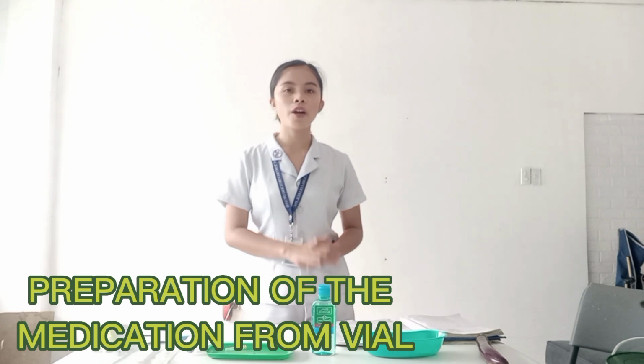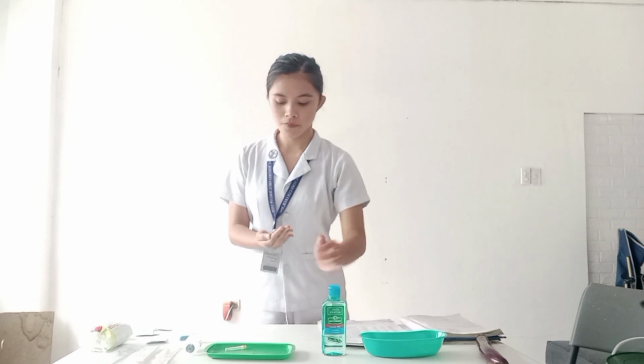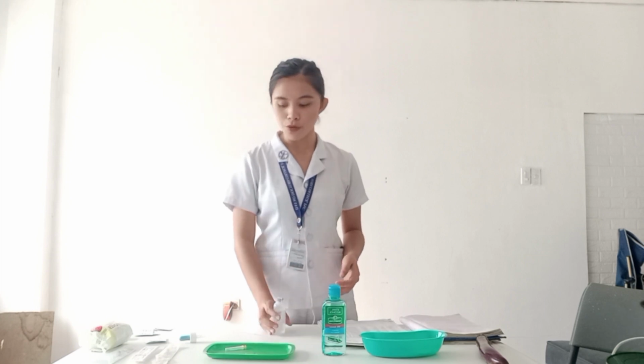Now I am going to proceed with the preparation of the medication from a vial. The first thing to do is to perform hand hygiene to deter the spread of microorganisms. Now I have to prepare the medication vial for drug withdrawal by rotating the vial between the palms of the hand and not by shaking it. Then I have to clean the rubber cap of the previously opened vial with an antiseptic wipe by rubbing it in a circular motion.